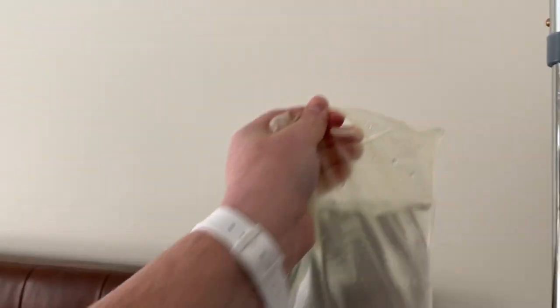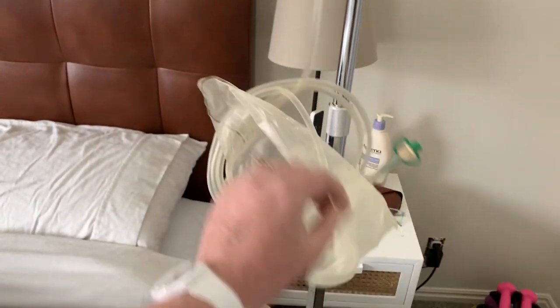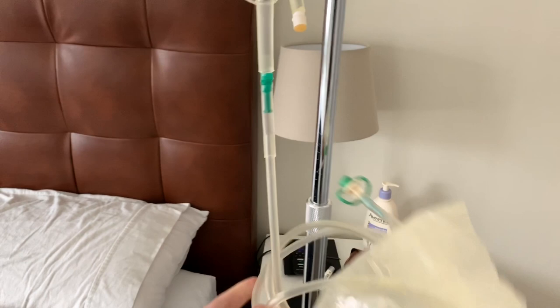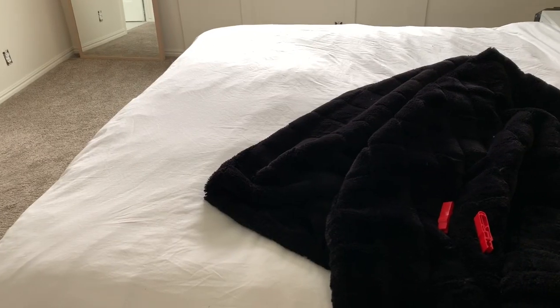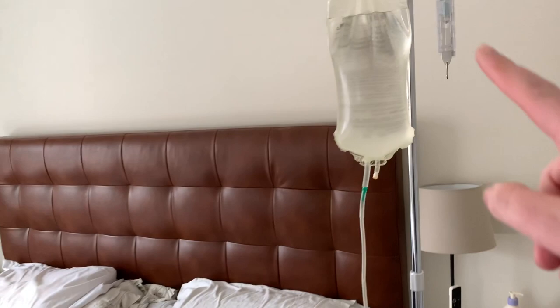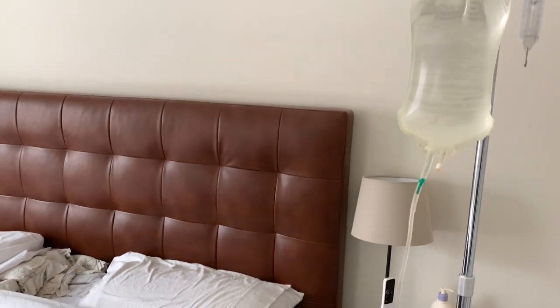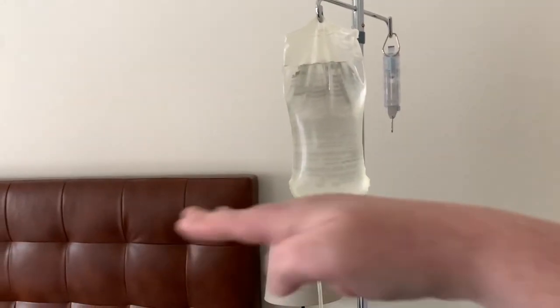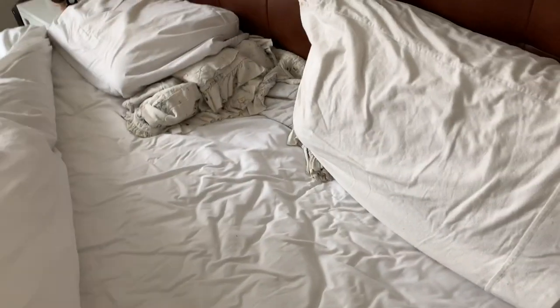First of all I'm going to take the bag and put it on the hook. I should have a camera person here, so let's see if I can do this one-handed. Sorry guys, it's sanitary so it's all stuck together — pull it apart. Here's my drain bag, here's my fill bag, and I have it on this IV pole because you gotta have some gravity assistance.